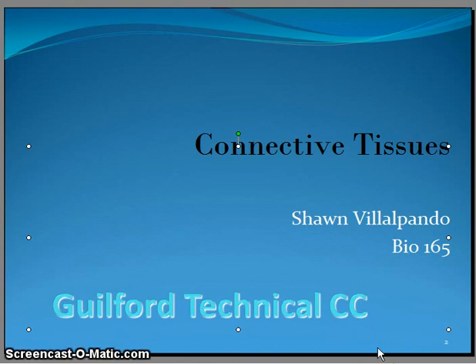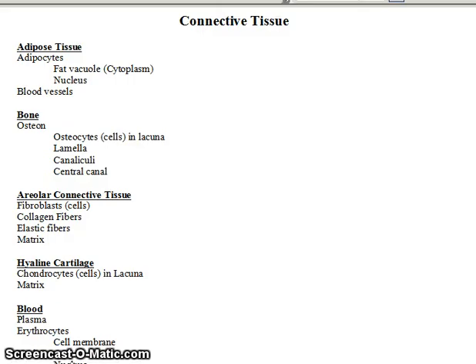This is Shawn Villalpando, and I'm a Bio 165 instructor, and what I'm going to do in this video is go over the connective tissues lab. So if I pull up the handout for connective tissues, you can see what we've got right here, and I'm just going to go down the list and take a look at some slides.